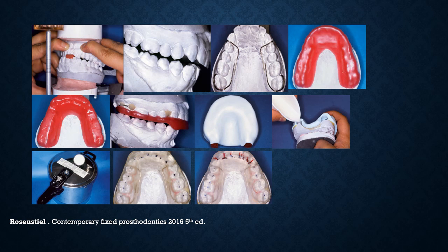Then after waxing, you form a silicone putty mold, so that after putting the wax in a hot chamber for wax elimination, cold cure acrylic is poured through the holes, and then curing is accelerated by putting the mold in the pressure cooker.